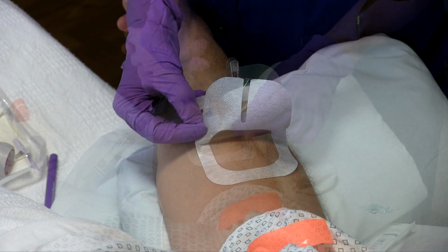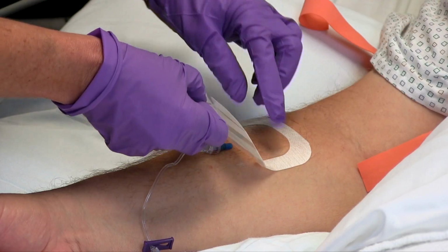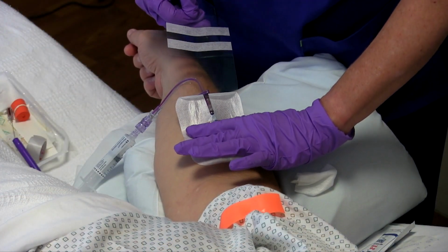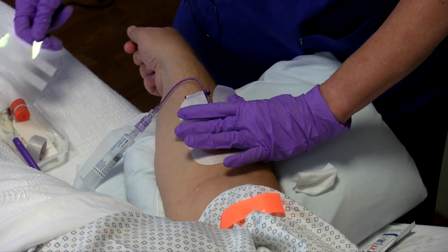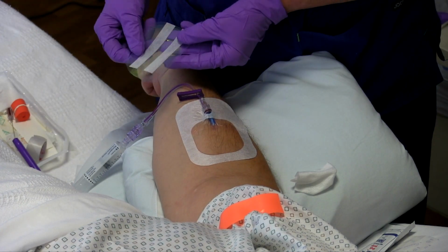Now grasp the tab on the split portion of the dressing and remove the film cover by pulling away from the insertion site while stabilizing the adherent side of the dressing. Set the film cover aside and note the location of the adhesive strips for later use.